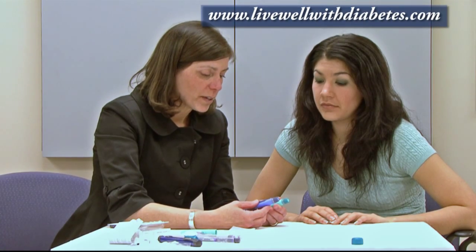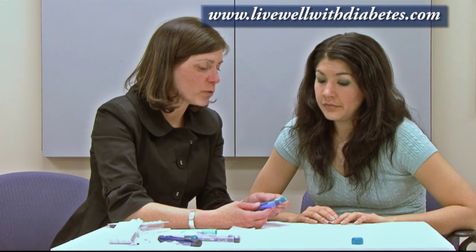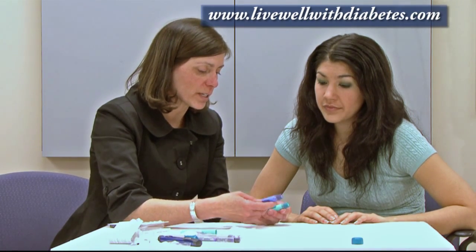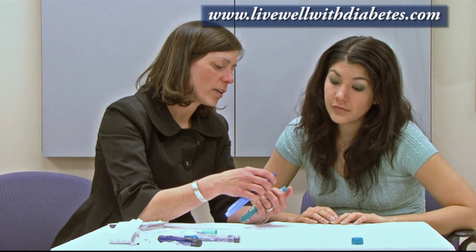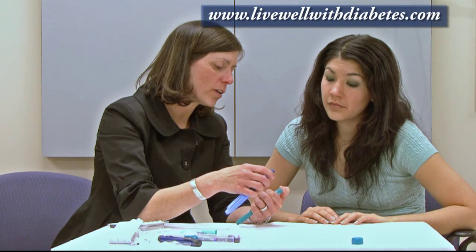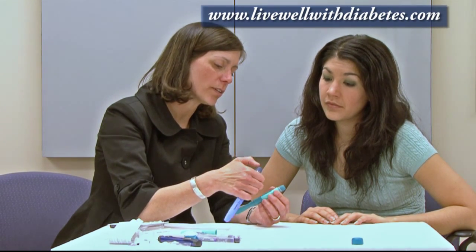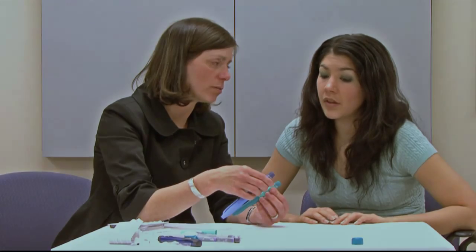The Auto Pen 24: the green one goes up to a maximum of 21 units and the blue one dials up to a maximum of 42 units. For people who are visually impaired, there is a dot on the end of each pen — the 21-unit pen has one dot and the 42-unit pen has two dots, so you can feel which pen is the correct one to use.